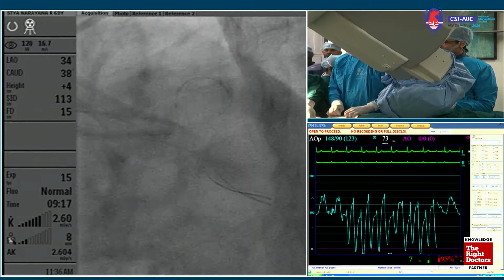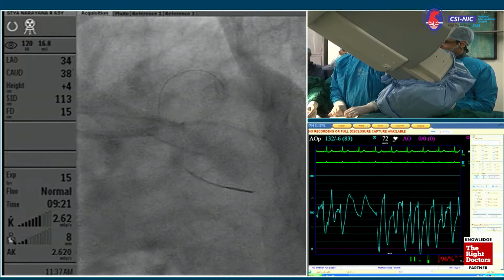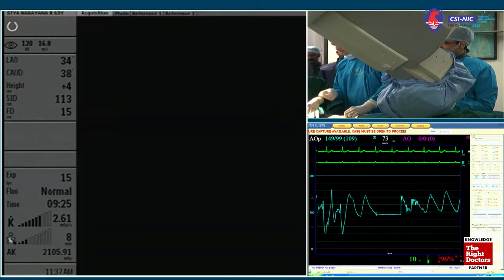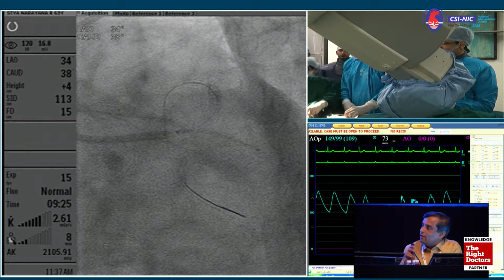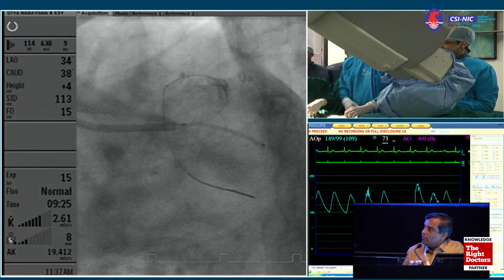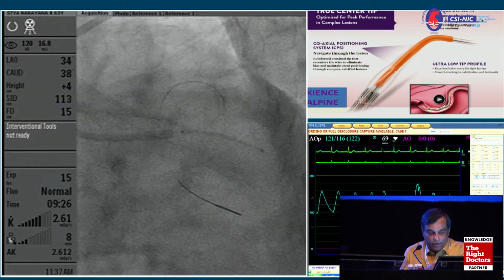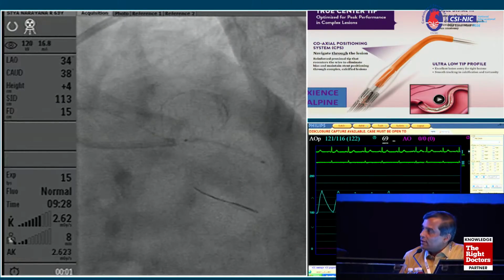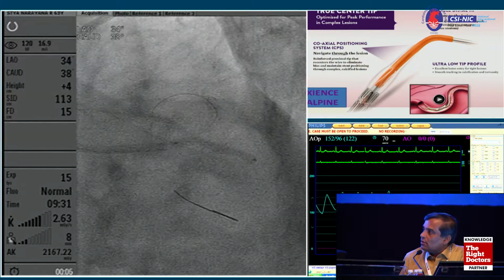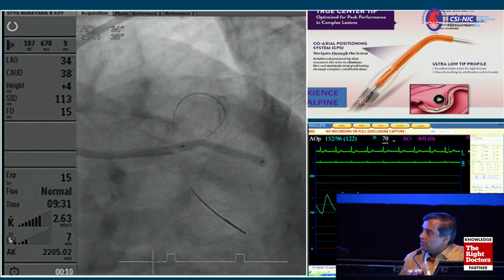I think in this patient we should first again discuss bypass versus angioplasty. You need to have some compelling reason to go ahead and do angioplasty with multivessel stenting. We are underestimating a little bit the risk of restenosis over a period of time, not only in the first year. If you look at long-term disease-free survival, bypass is definitely good. But when you do such techniques, would you like to consider rota first to have better apposition of stents? That is the most important point which may decide the long-term survival of the stents in this patient.